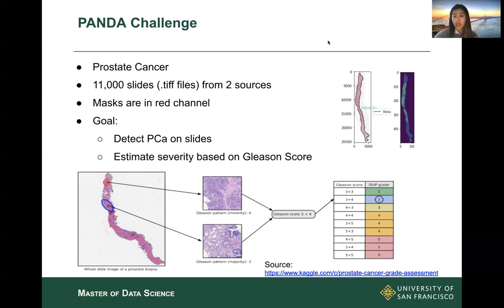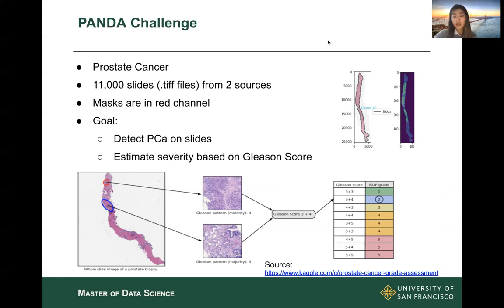All the information of cancer cells is stored in the mask — in this case in the red channel of the mask. Looking at the bottom image, the circled areas contain cancer cells, each with a Gleason score showing how severe they are. For one data source, values 0, 1, 2 are background, non-tissue, and normal cells, while 3, 4, 5 are cancer cells with different severities. The other source only has three levels, which is a problem to figure out later.